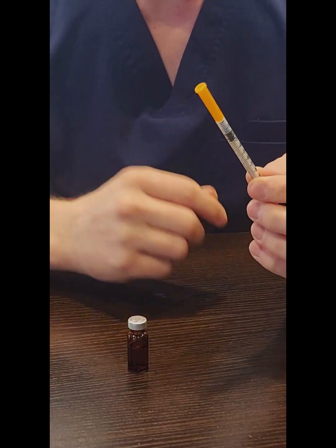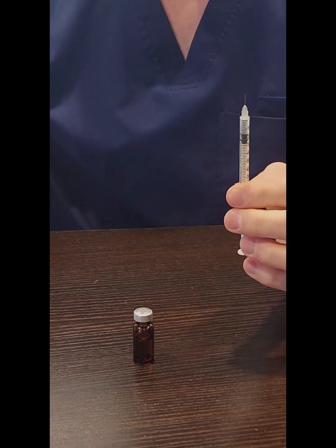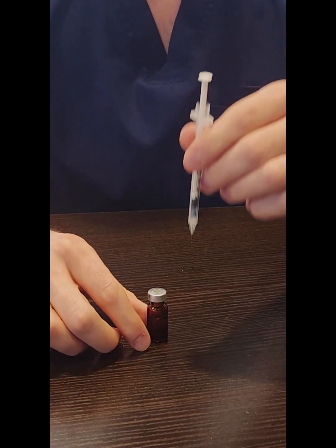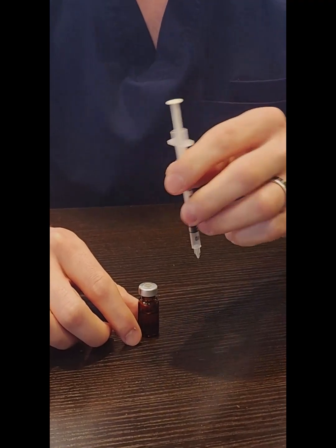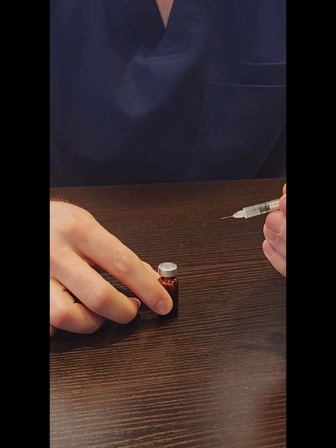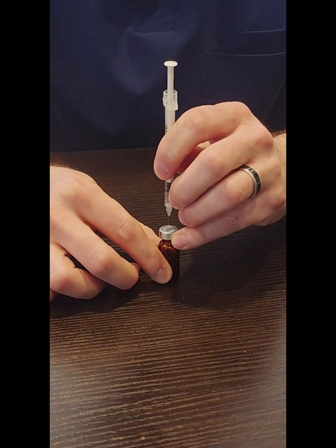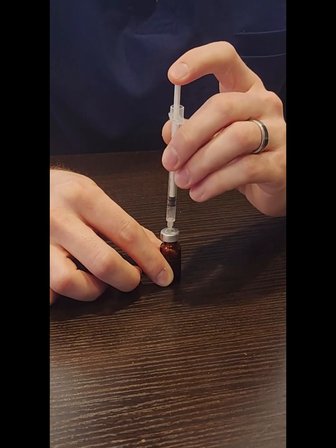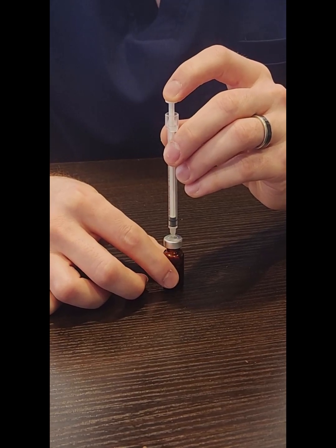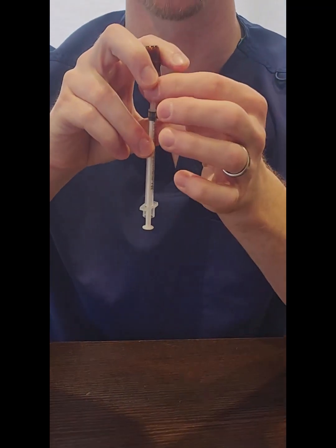Once we've done that, remove the smaller orange cap to prepare to stick the syringe through the rubber. You want to go through the center of the rubber as much as possible — if you put too much pressure on the sides, you can potentially bend the needle. I recommend you hold the vial down on the tabletop with one hand, and then with your other hand, as close to the center of the rubber as possible, go straight through. Once the needle is all the way through the rubber, push the plunger all the way down. Being very careful not to bend the needle, flip everything over so that the medication vial is on top of the syringe and upside down.